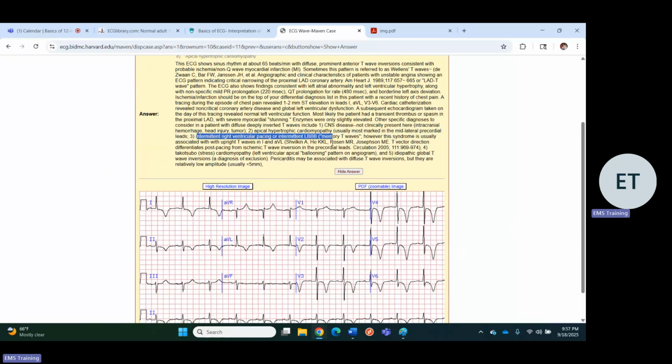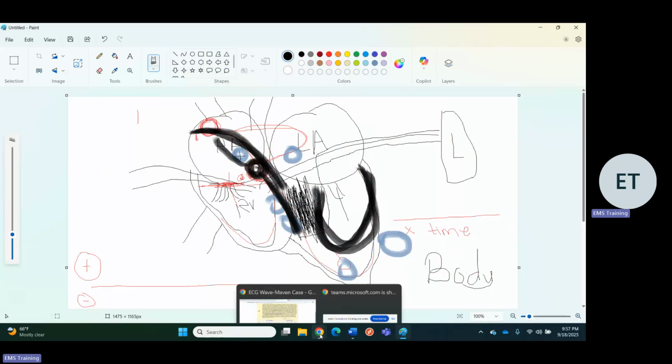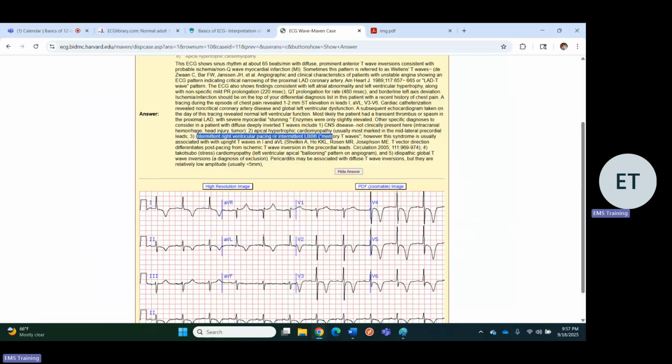Yeah, yep. If it was present enough to cause cardiac remodeling, go back to this, right? As the heart remodels, it begins to restructure and then things work differently. That's called cardiac remodeling. But let's say it's rate induced and it's only like that when their heart is beating fast, and now they're at rest, and when they're at rest, it goes back to normal. So you could have a non-wide QRS complex, but they could have had this intermittent bundle branch block for so long that cardiac remodeling actually took place. I forgot about that. That makes sense.